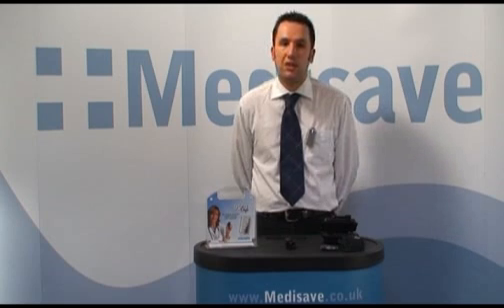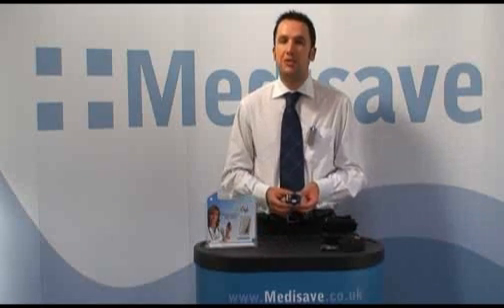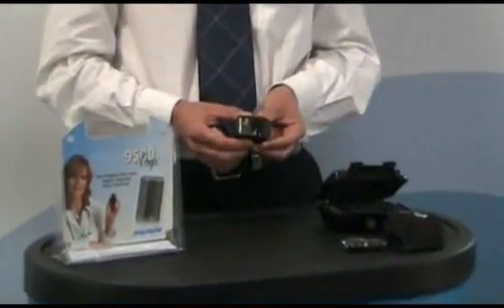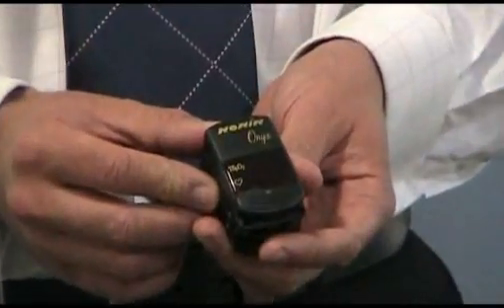Welcome to the Medisave demonstration of the Nonin 9500 finger pulse oximeter. This is the best selling pulse oximeter currently available on the market. This is down to it being easy to use, durable, reliable, and economical to purchase and also run.